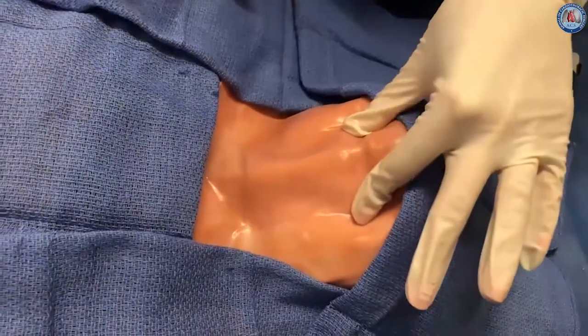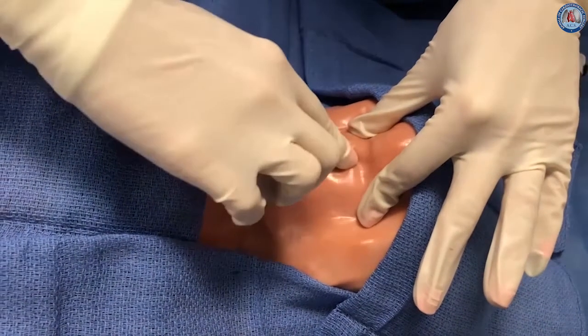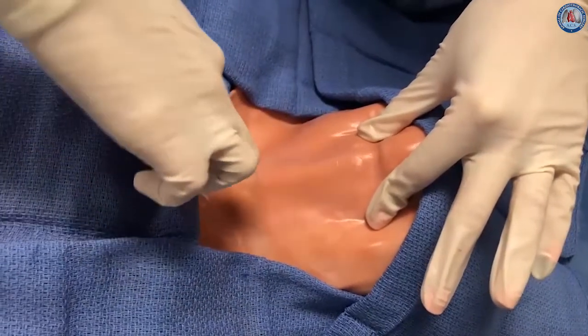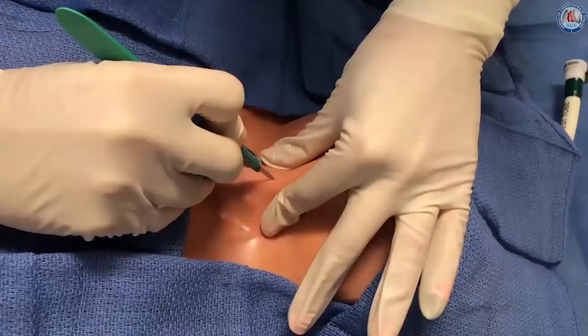The procedure begins with identification of surface landmarks. In this view the patient's head is to the right. First the thyroid and cricoid cartilages are found cranially, the sternal notch caudally, and the incision is planned for approximately midway between these landmarks.